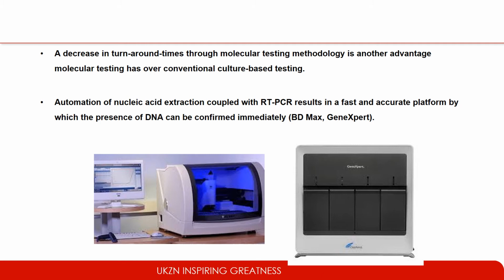The technology has become more sophisticated in that now we have closed systems. You would have probably heard of the most famous system known as the GeneXpert, which is a point-of-care system for the detection of rifampicin-resistant tuberculosis. In this type of real-time PCR system, there is no need for the first step of DNA extraction.